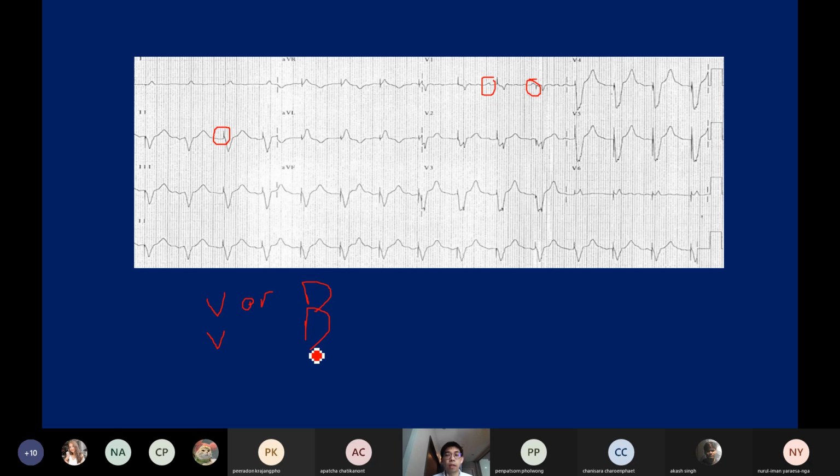But the next thing we know for sure is that the PR interval is not constant. The atrium and ventricle are not tracking each other. So from this ECG, the third letter should be I. For the answer from this ECG, it should be VVI or DDI.